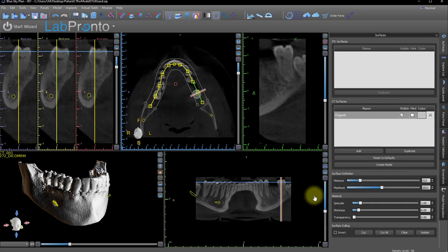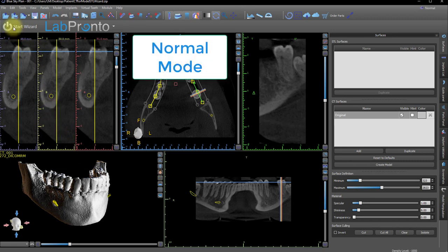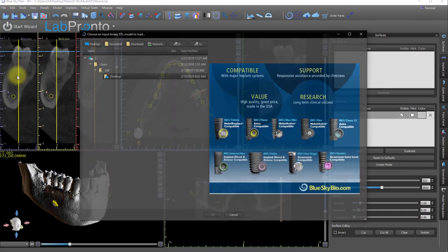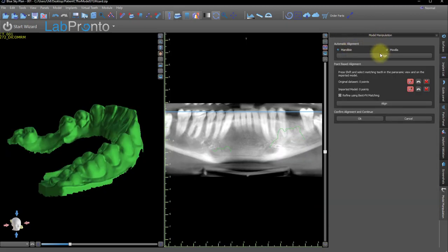The auto-alignment will also work in the non-wizard modes. We'll show it in normal mode. The DICOMs have already been loaded and the nerve identified. We'll click on File and Import STL Model. The navigation screen comes up. I'll double-click on the model file saved on the desktop. The model manipulation panel will appear — click Align under the automatic alignment.